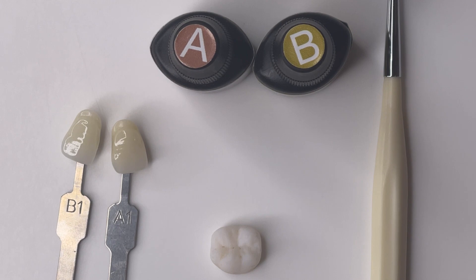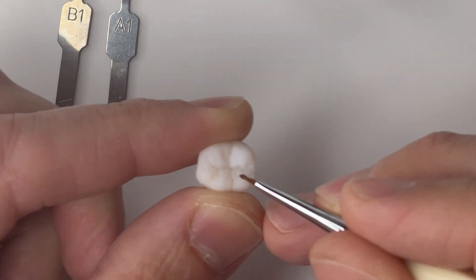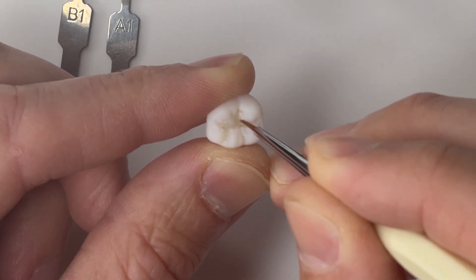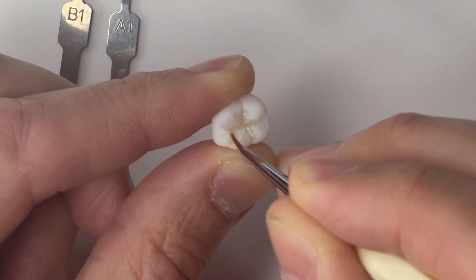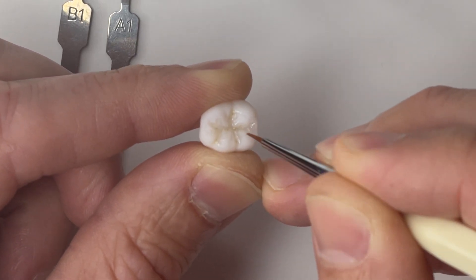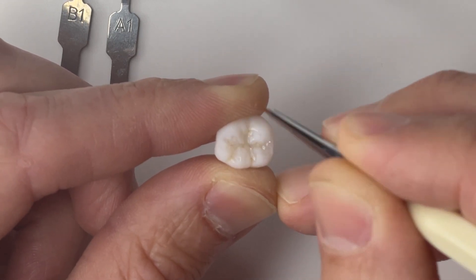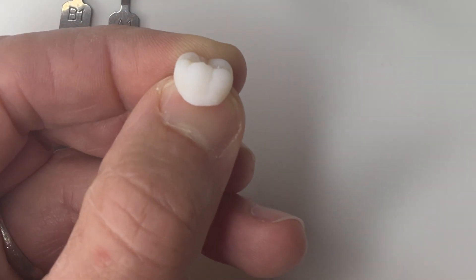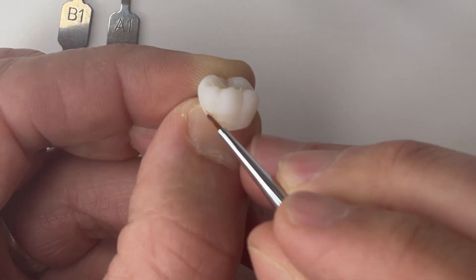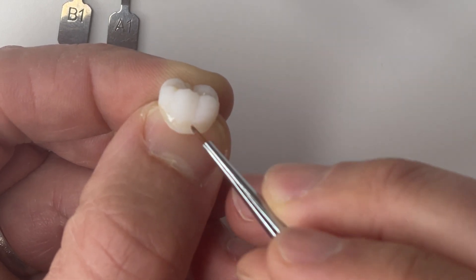First thing I'm going to do is start in the areas where we want the most chroma. I'm staining this molar to an A1, so I want to add the most in the grooves and also in the cervical third. That's where I'm going to start, because you're going to add increased chroma by layering multiple layers — in this case A Plus Opti Glaze.